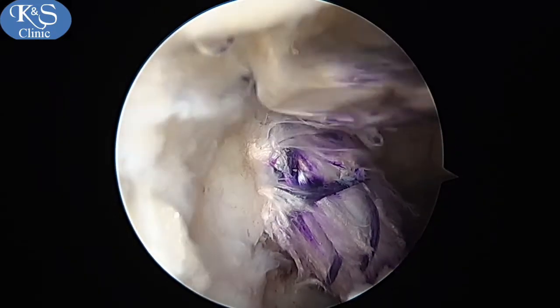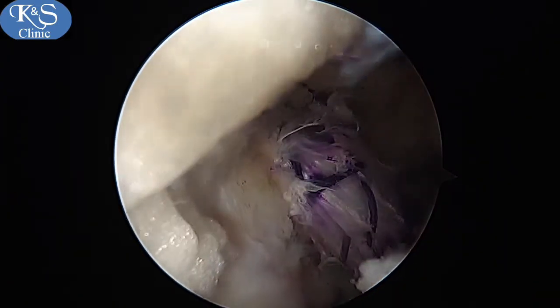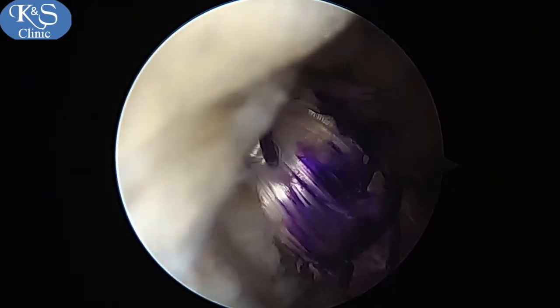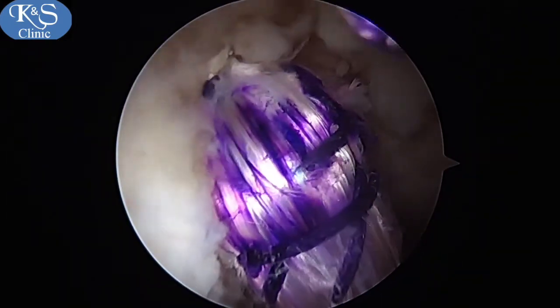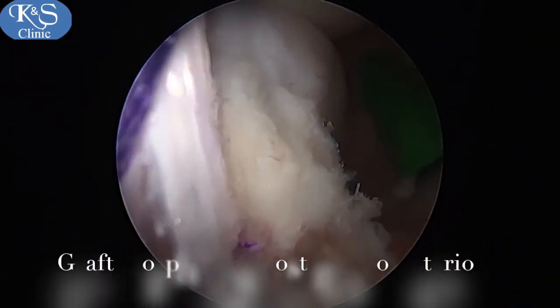This continues until the mark indicating that an adequate amount of graft has passed through the femoral tunnel is reached. The graft can be seen all the way from the femoral tunnel back into the tibial tunnel, and here you can see it being milked all the way up. The whole graft morphology can now be seen from the front.